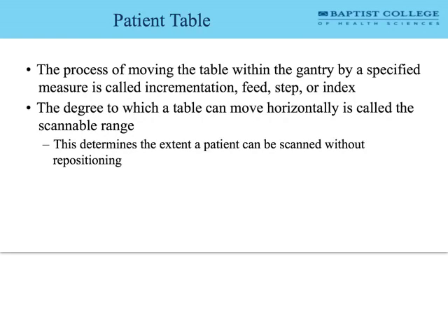The scan table also has this indexing system that's directly associated with it. So it has a separate computer that controls just the scan table, and it is tied to the data that you're getting during data acquisition. This is an important part of CT scanning, that we can tie the image data that we're getting to a specific spatial place on the patient.